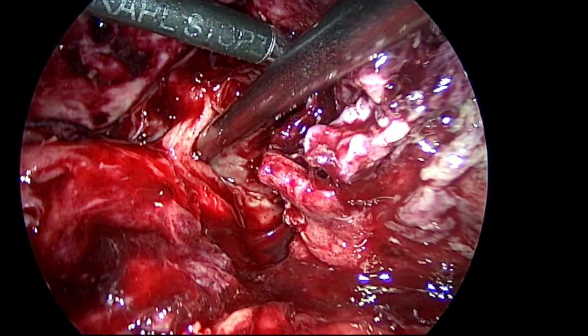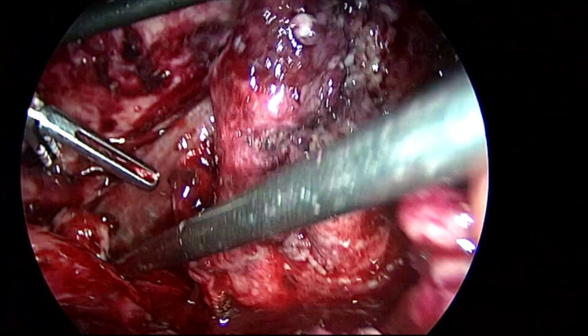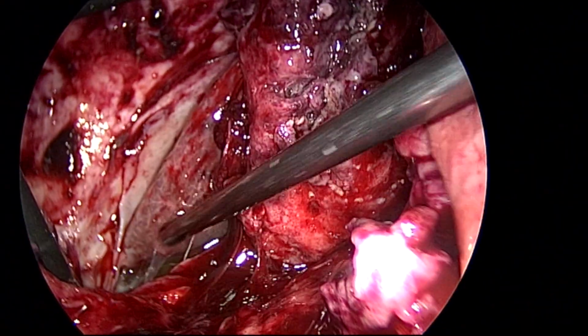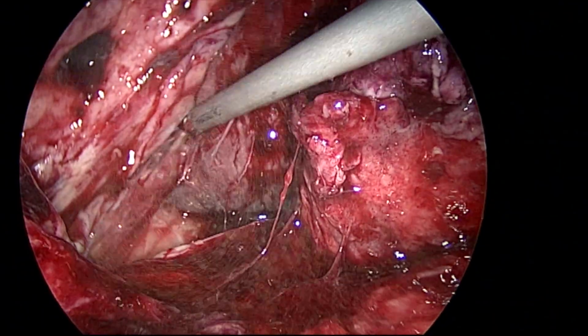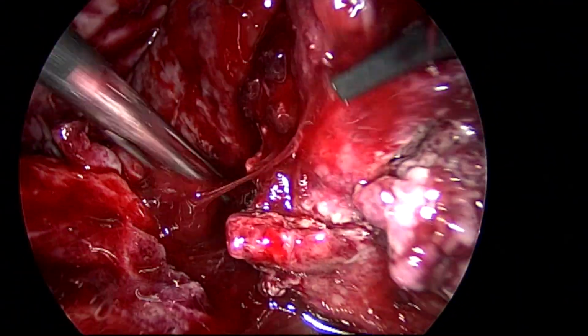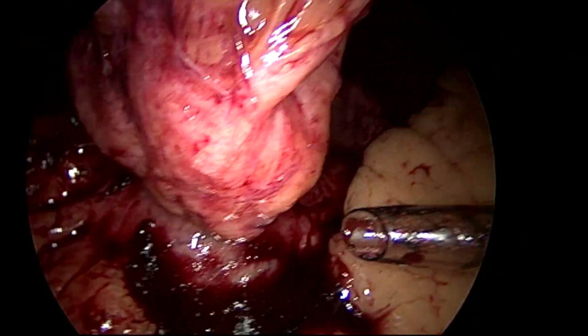So, once I find the infundibulum and lift it from the surrounding structures, then I can identify the Calot's structures very well. The critical view of safety can be identified. So, that is my aim. Now you can see the inferior surface of the right lobe, and I could enter the right lateral side. Only the medial side is still attached, so I am not able to proceed.